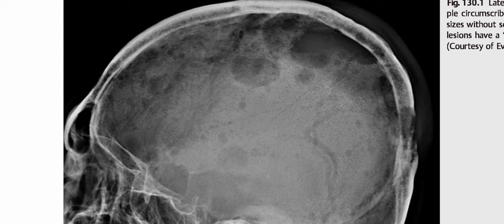These are images of a 42-year-old man presenting with generalized aches and pain. On the lateral skull radiograph, there are multiple circumscribed calvarial lucencies of varying sizes without sclerotic margins, and many of these lesions have a typical punched-out appearance. These lytic skull lesions in an adult patient — the top differential considering this typical punched-out appearance — is multiple myeloma.